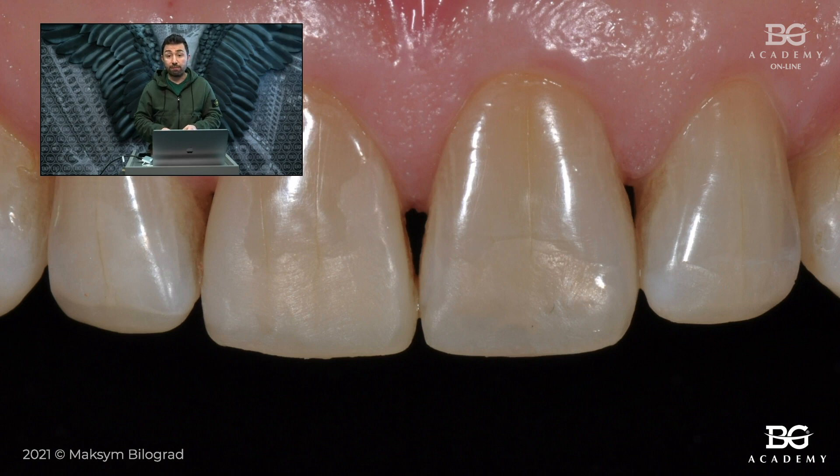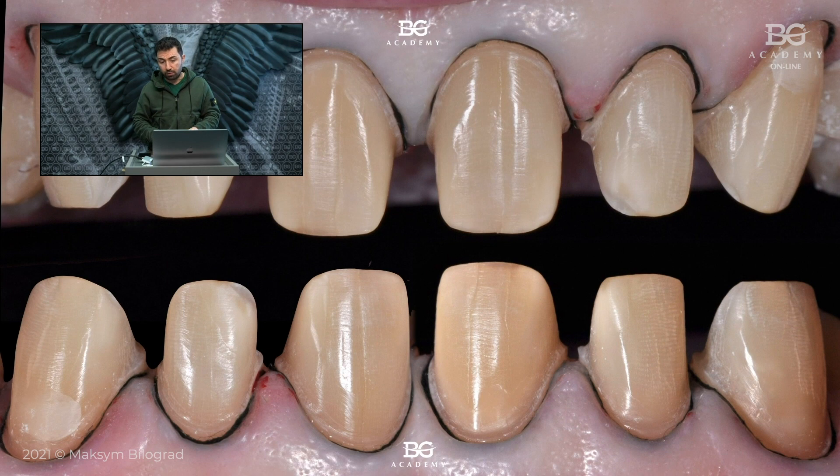We then transferred this information to the dental lab by making an impression. This case was done in 2012, so it is a pretty old case. My dental technician made a wax-up considering the length of the frontal teeth that I gave him, then we made a mock-up and then we started preparing the teeth of this patient.